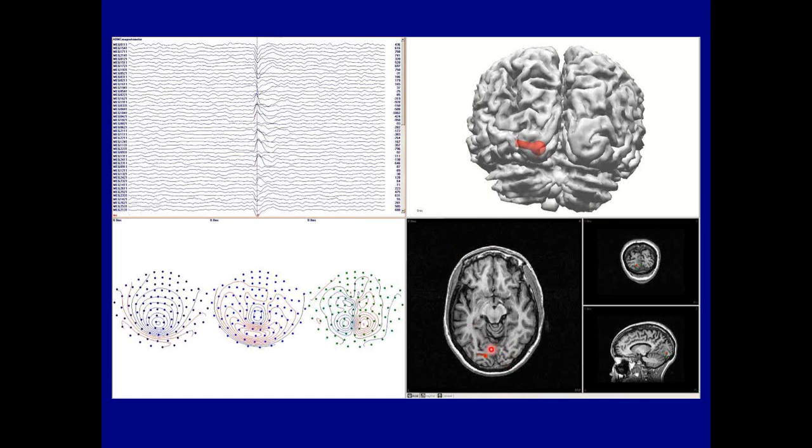Here's our MEG localization. It says, no problem. This is a mesial occipital on the left side. I forgot to tell you, all my 2D MRI images are anatomical, left on left, right on right, so that they match the 3D images above. Sorry, I didn't tell you that earlier, but you could tell from the 3D MRI reconstruction.